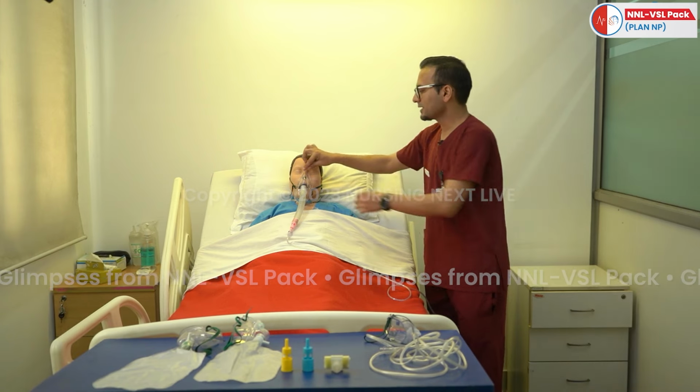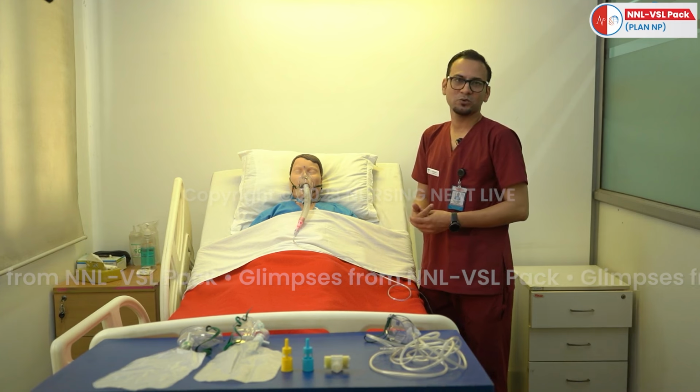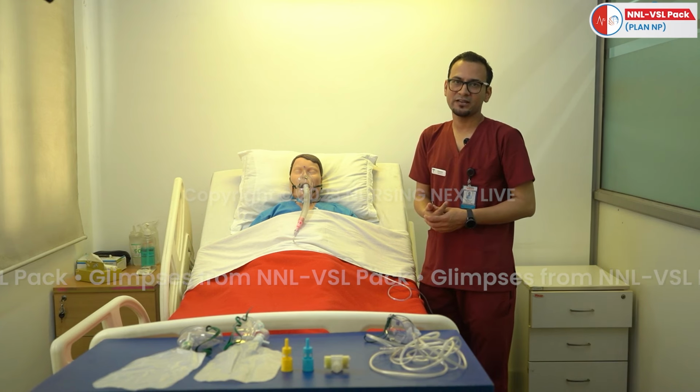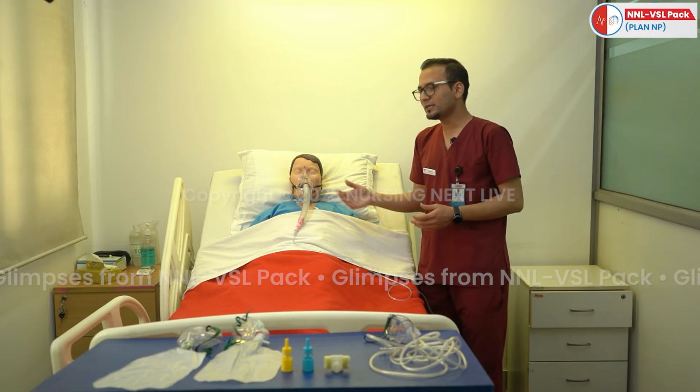And this mask comes under the high flow oxygen devices, and it is widely used for patients who are on controlled oxygenation. It is contraindicated for those patients who have decreased respiratory effort, apnea and severe hypoxia. So this is all about the Venturi mask.